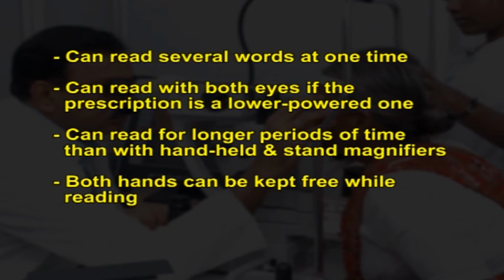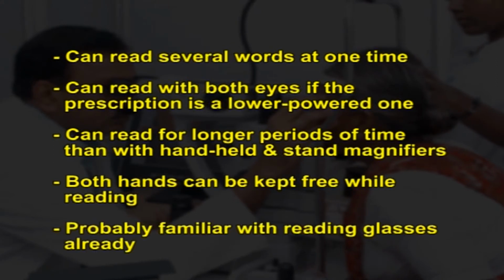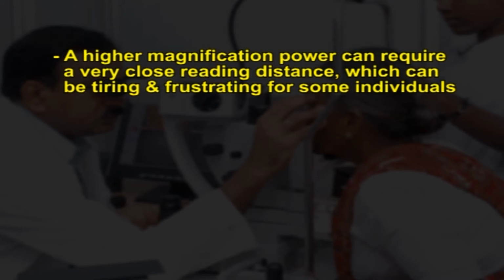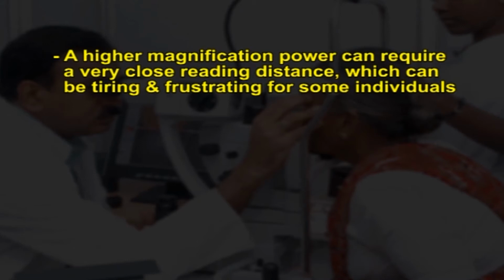Both hands can be kept free while reading. Probably familiar with reading glasses already. Some of the disadvantages are, a higher magnification power can require a very close reading distance, which can be tiring and frustrating for some individuals.